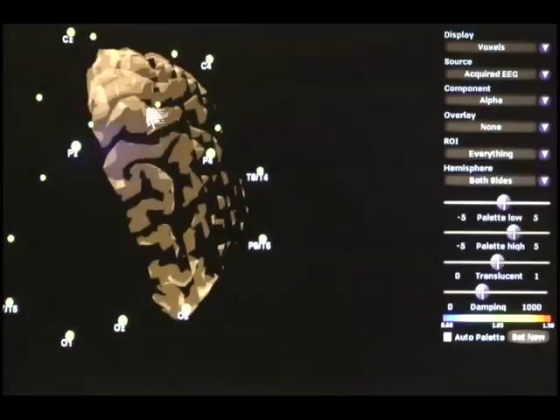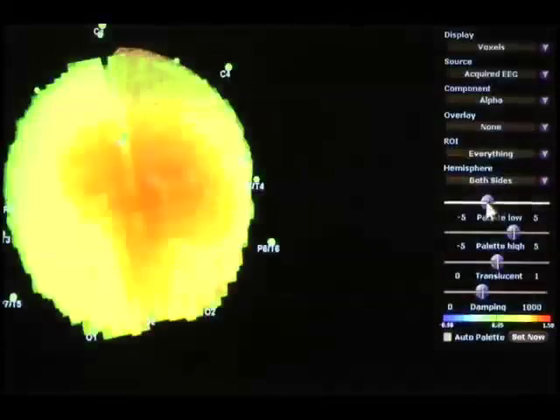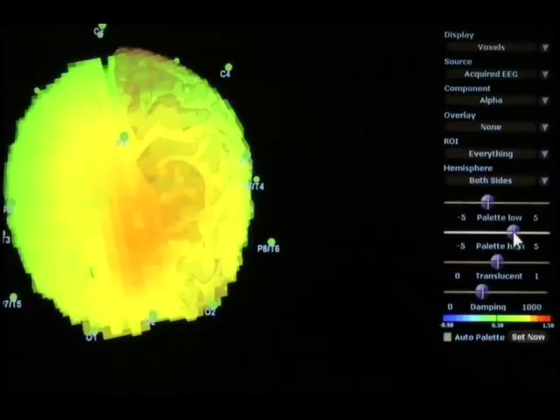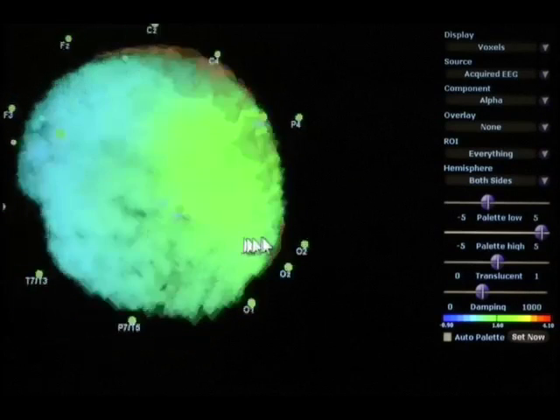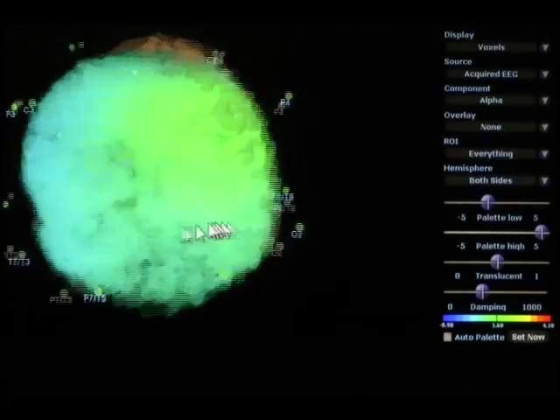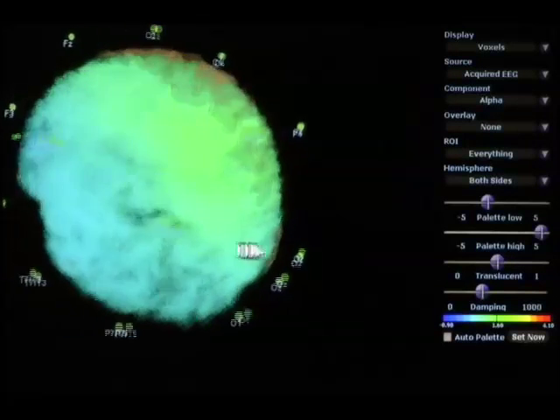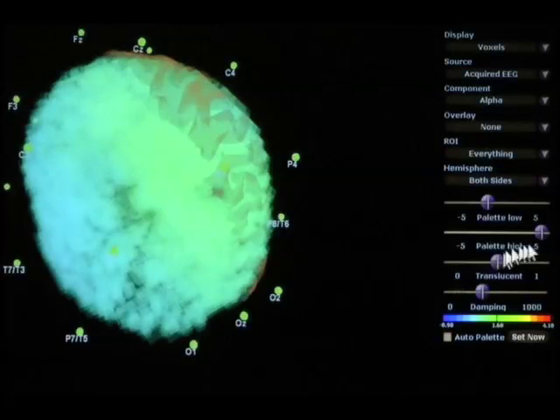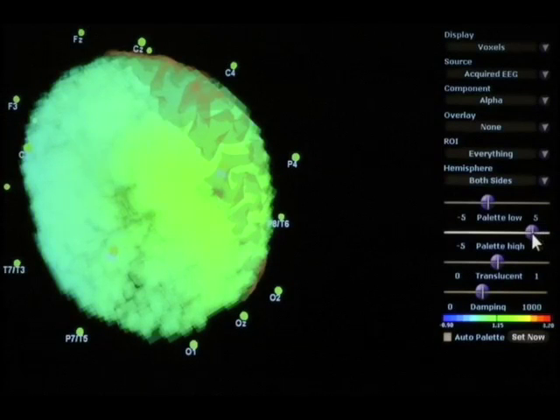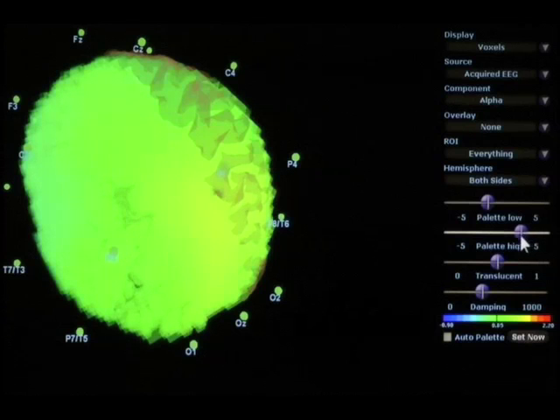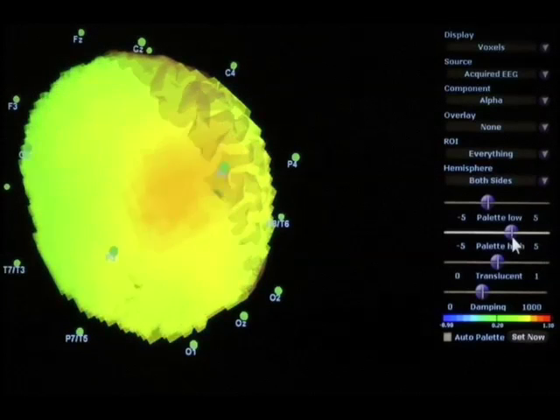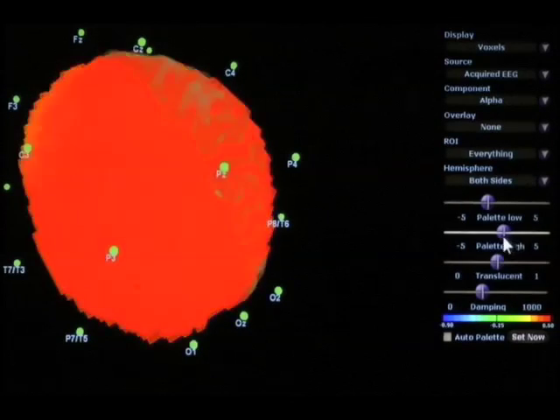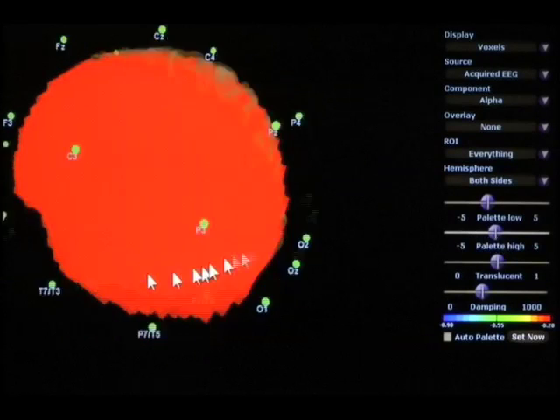Now let's look at palette high. Palette high is the value which is red. If I slide it over to the right, it makes it harder to achieve red. In fact, none of the image is red when I slide palette high all the way to the right. If I slide it to the left, I'm going to begin to see some red. If I just slide it a little bit, I can now pinpoint another focal area. If I slide it more to the left, eventually the whole head becomes red.